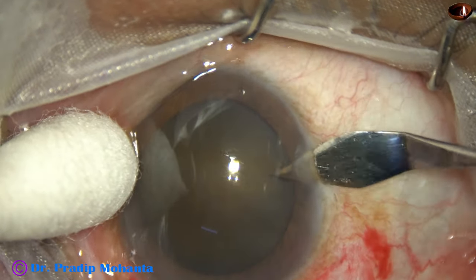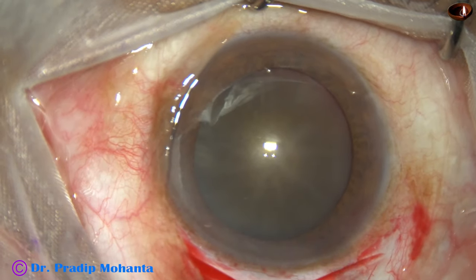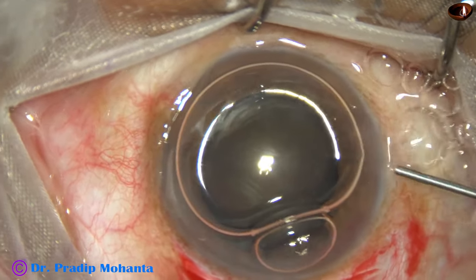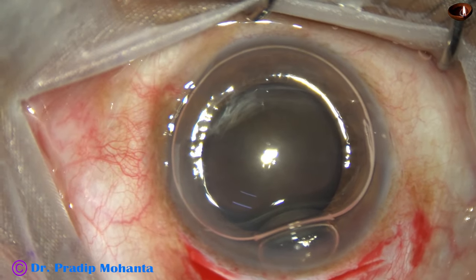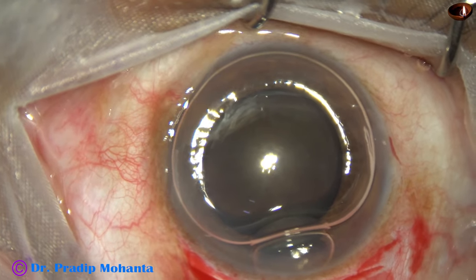This is the side port. With the keratome itself, we introduce only half of the keratome to get an adequate-sized side port.